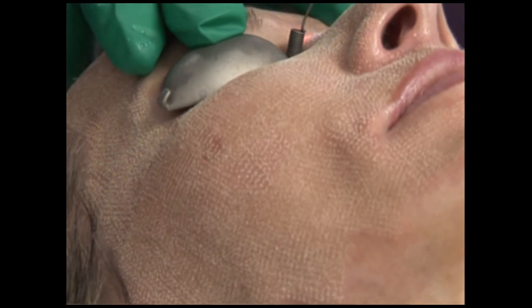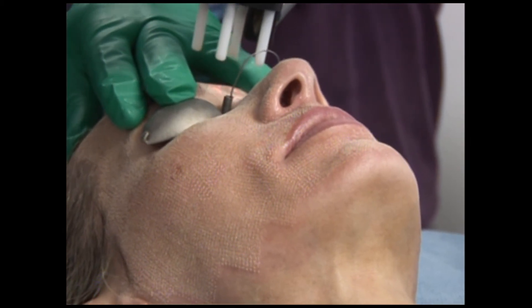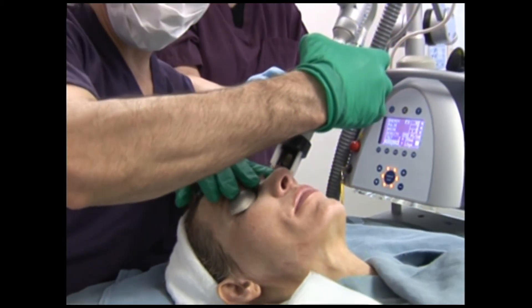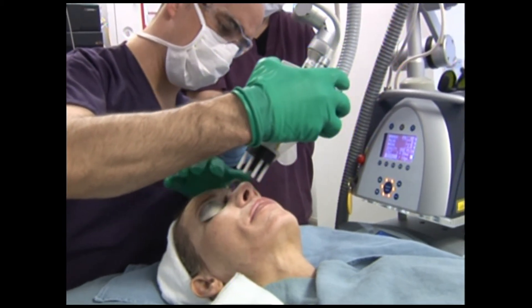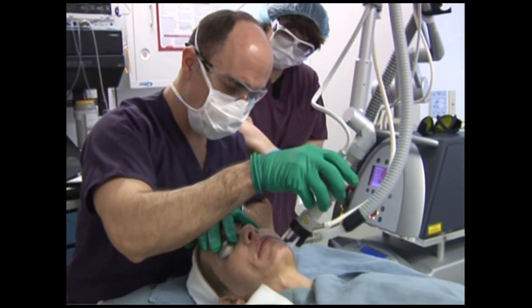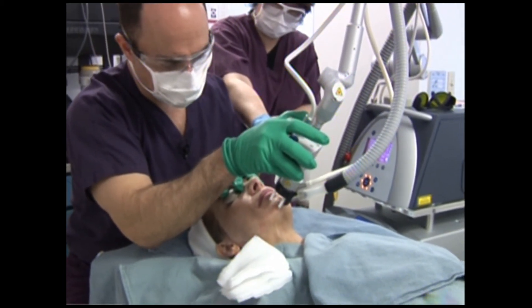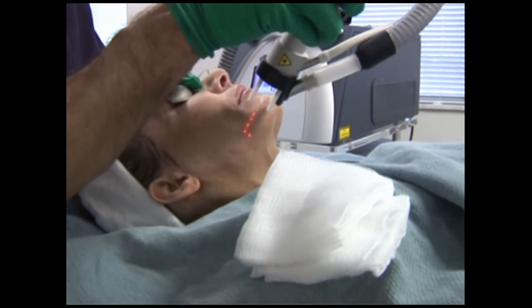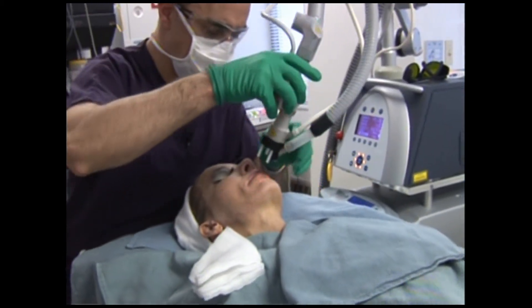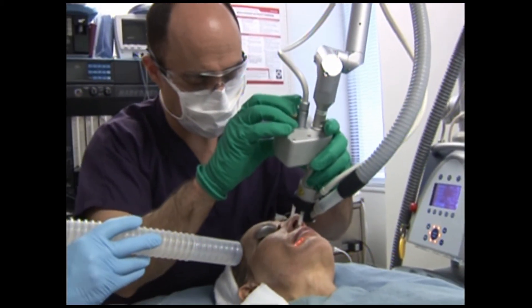It's a wonderful attribute to be able to communicate with the patient while the treatment is being done. With the older fractionated CO2 lasers, I would do something like a rhinoplasty and nose surgery and then treat with the laser at the end. The anesthesiologist would tell me they needed more pain medicine for the patient during the laser than during the nose job.